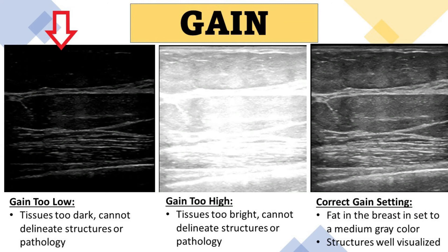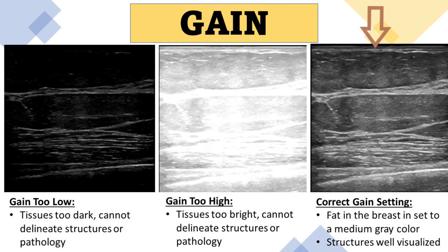In the first image, the gain is set too low — the breast tissue is too dark and you cannot delineate structures or pathology. In the next image, the gain control is set too high — the breast tissues are too bright and you cannot distinguish the structures or layers of the breast tissue or visualize pathology. In the next image, the correct gain setting is used — the fat in the breast is a medium gray color and the structures, tissues, and pathology in the breast are well visualized.